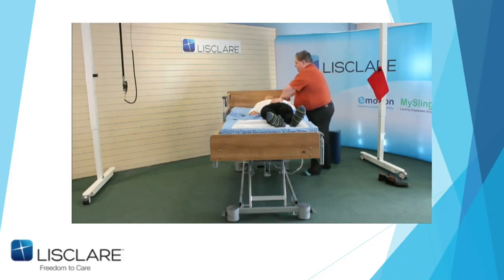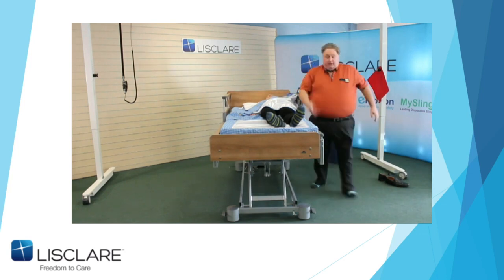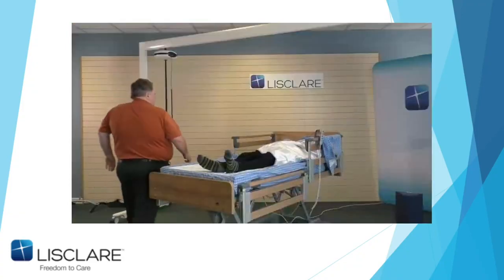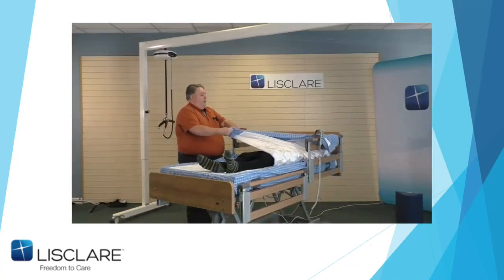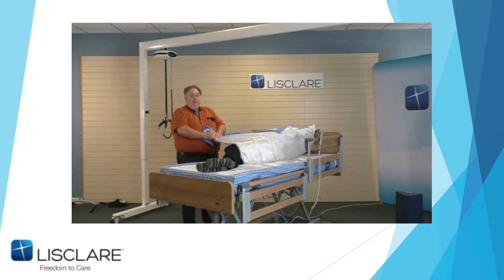And at this point, John's going to help a wee bit because I'm going to fix his cushion. Okay? I would then set that across there. Lift that side wheel, believe it or not. And I can lift this one. I'll walk around here. And at this point, and I can very simply turn John.